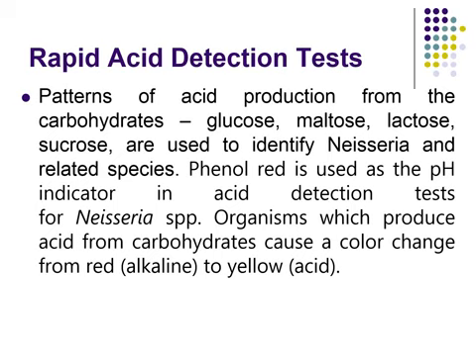The fermentation leads to acid production, detected by phenol red as an indicator. An organism which produces acid from carbohydrate causes a color change from red to yellow.